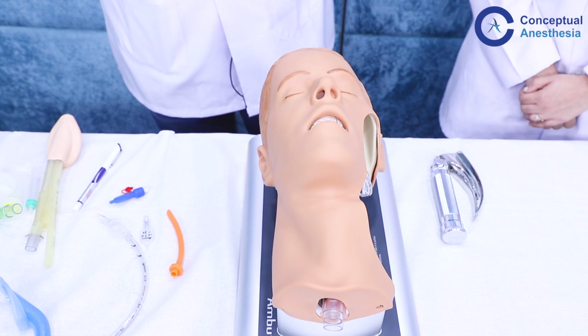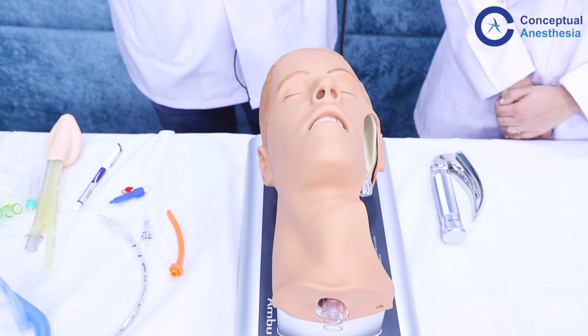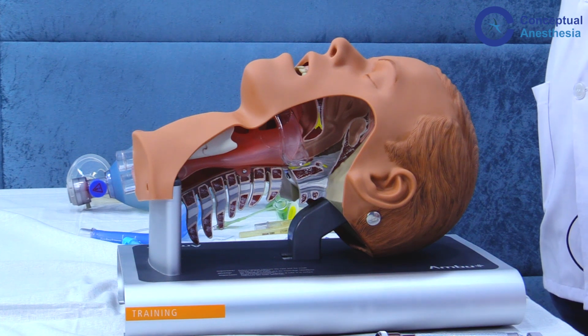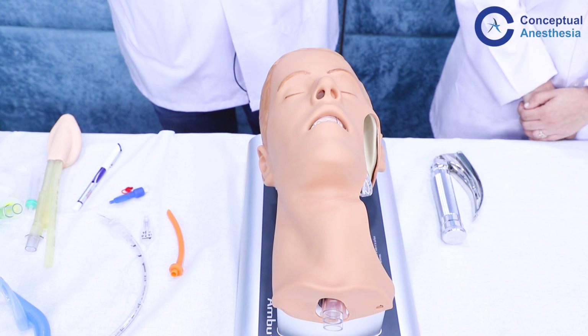So that is how we carry out securing the airway. So we have discussed how to do endotracheal intubation, mask ventilation, supraglottic airway device insertion, oro and nasopharyngeal airway insertion, and the front of neck access.